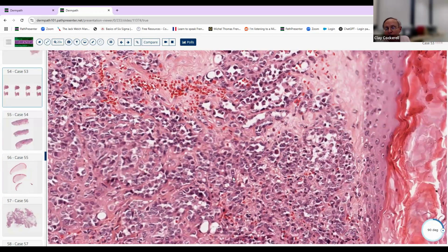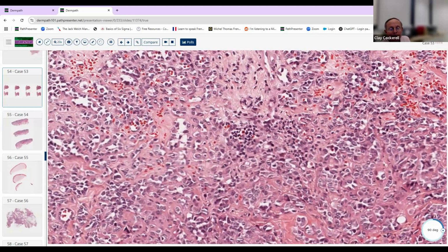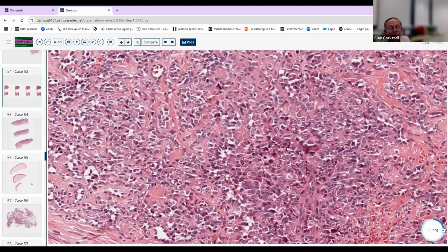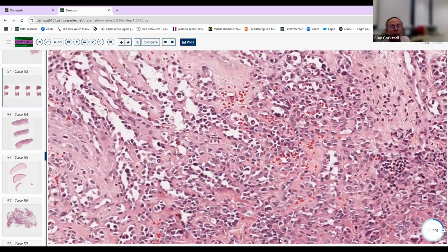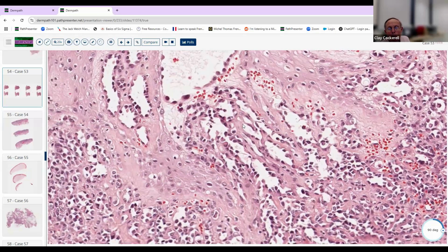And these cells are very atypical. They vary markedly in size and shape. There are a lot of cells that are necrotic. There are cells that are in mitosis in here. And this up here demonstrates these blood vessel changes with this staghorn morphology and these atypical endothelial cells that are floating freely in the lumen of these atypical neoplastic blood vessels. This is a classic angiosarcoma.